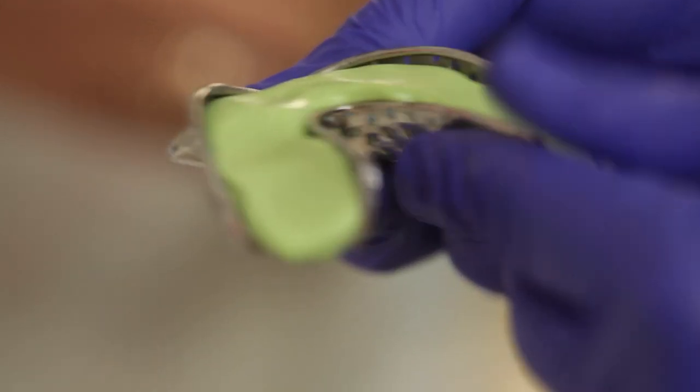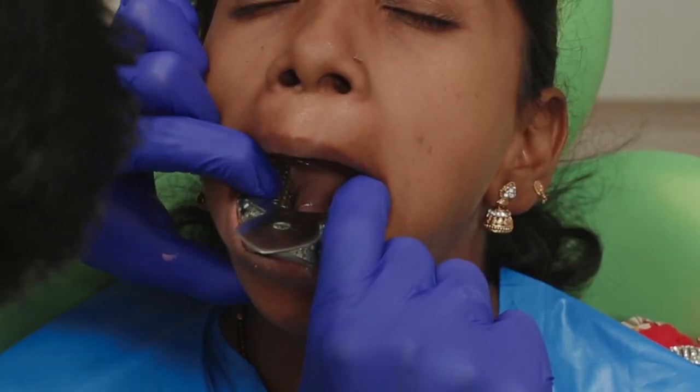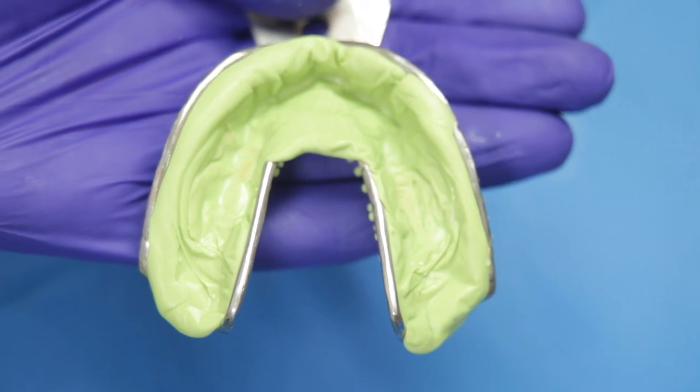My assistant will now mix the putty and load it onto the tray. I also have a plastic spacer ready, which will ensure uniform space for the wash. The spacer then goes on top and I place the tray inside the patient's mouth. Once it's set I can get the tray out, and you can see that there is uniform space created because of the spacer.